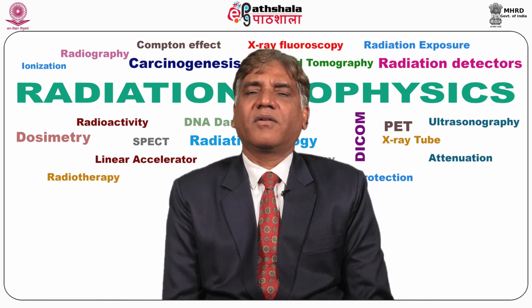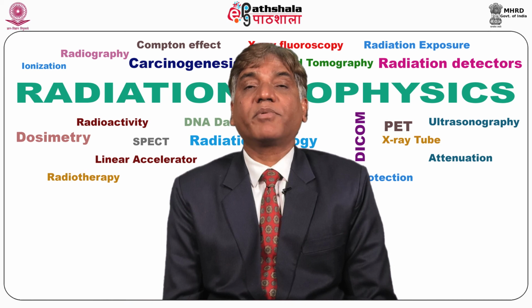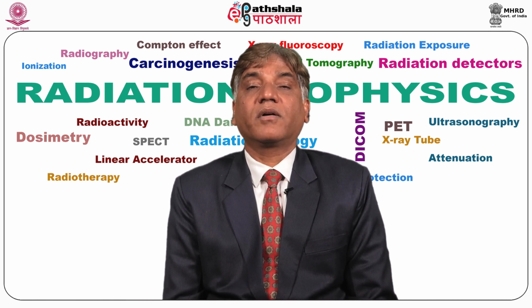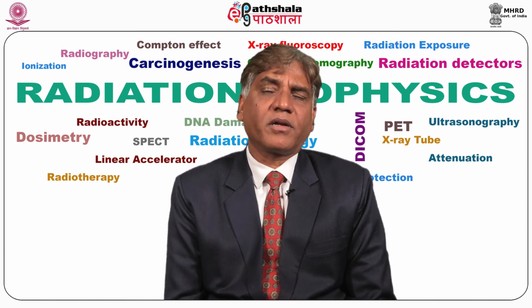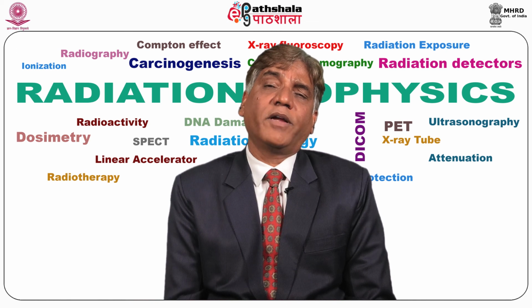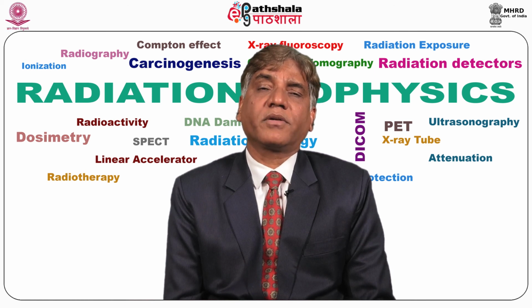There are 5 techniques in blood flow imaging. One is the continuous wave Doppler, we have the pulse wave Doppler, we have the duplex Doppler, we have the duplex color flow imaging Doppler, CFI, color flow imaging, and the power Doppler.